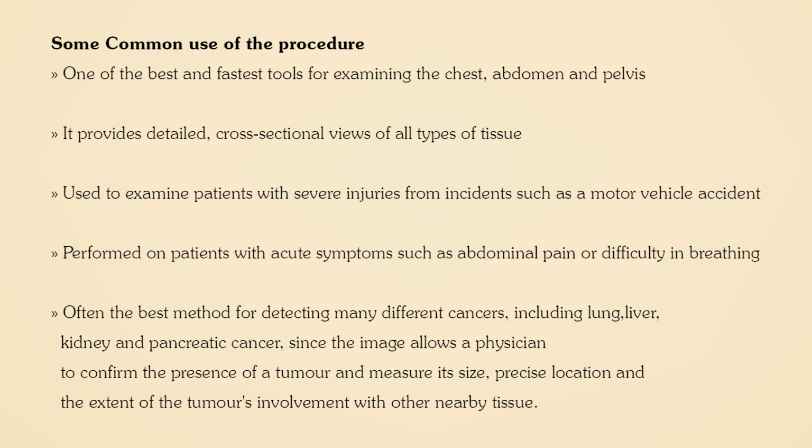CT scan is performed on patients with acute symptoms such as abdominal pain or difficulty in breathing. It is often the best method for detecting many different cancers including lung, liver, kidney and pancreatic cancer, since the image allows a physician to confirm the presence of a tumor and measure its size, precise location and the extent of the tumor's involvement with other nearby tissue.